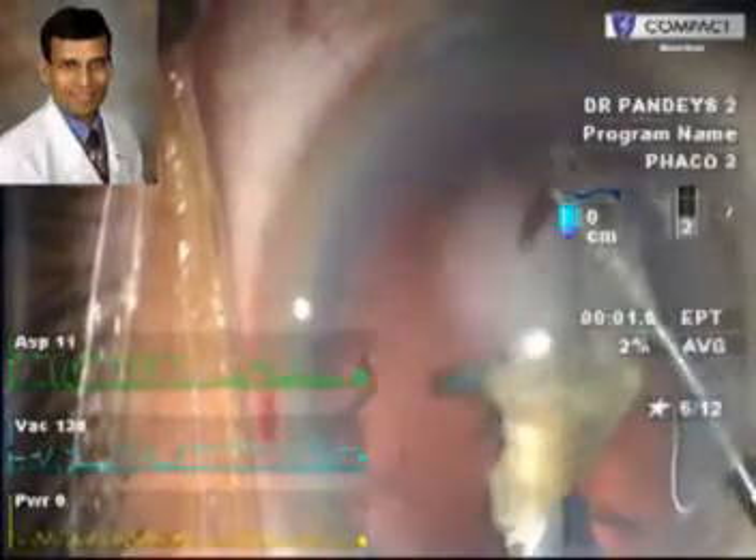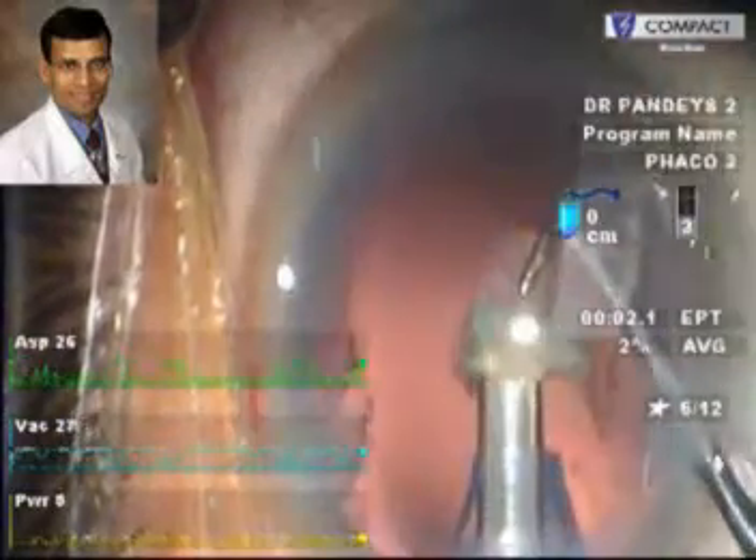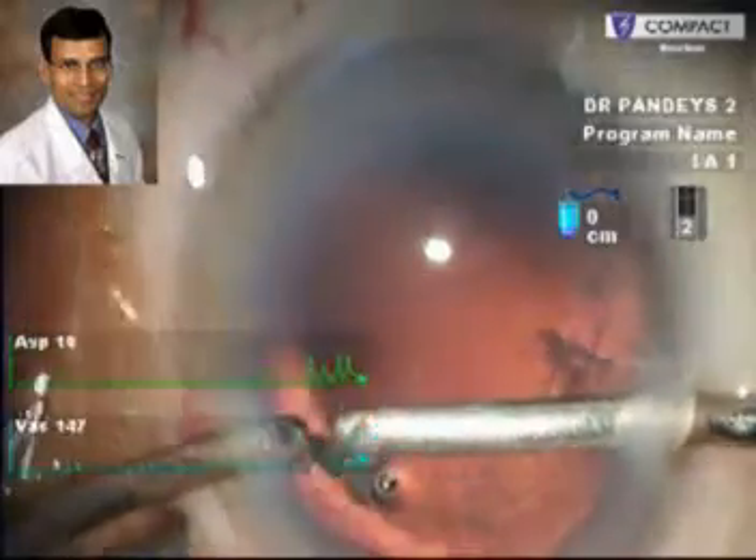Once the entire nucleus has been removed, we do a careful irrigation aspiration, cleaning the capsular bag thoroughly. This is the IA being performed — a bimanual irrigation aspiration which is helpful for a better cleaning of the capsular bag.